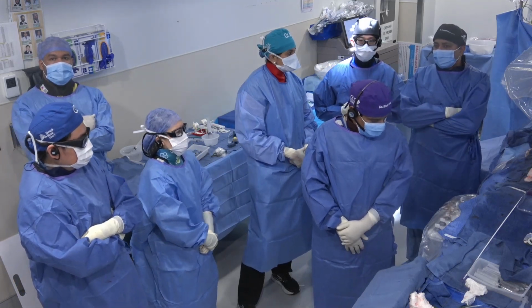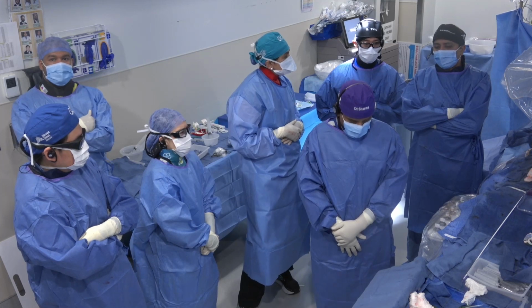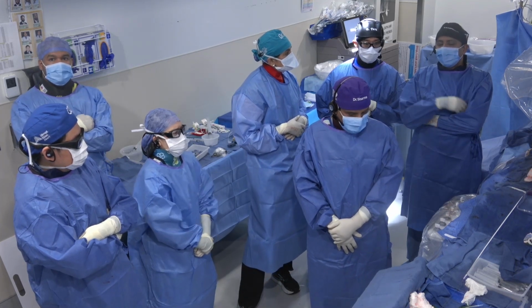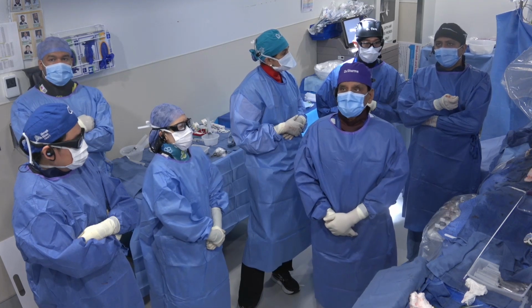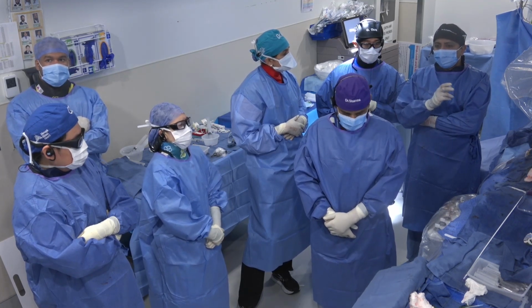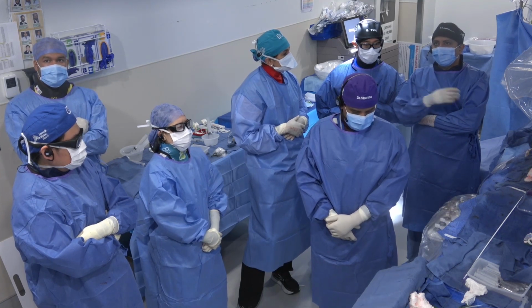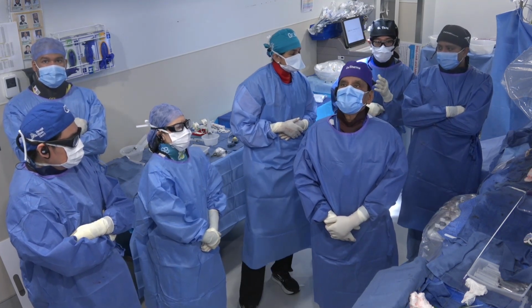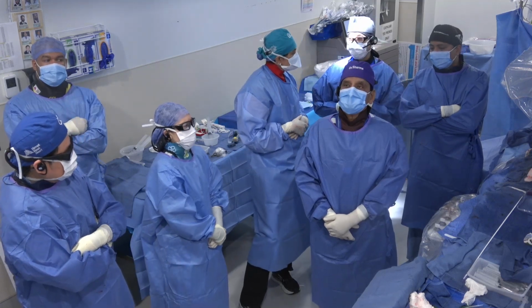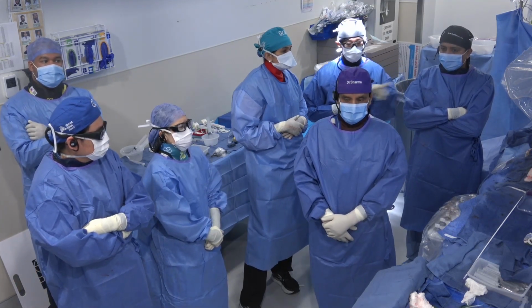The expansion actually happens on both sides, and we've seen more of that in TAV-in-TAV cases. That's why we usually start a little lower than what we think we should, especially if foreshortening happens from both sides, you're going to expect a more shallow position than the final deployment position. So you have to make sure you don't obstruct the coronary by mistake, or embolize into the ventricle if it's from the top. You have to go with fine adjustment with the two operators.